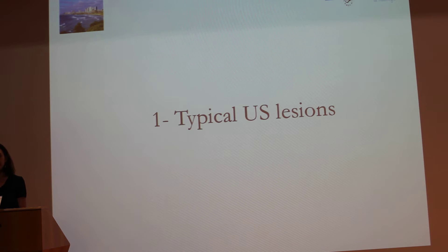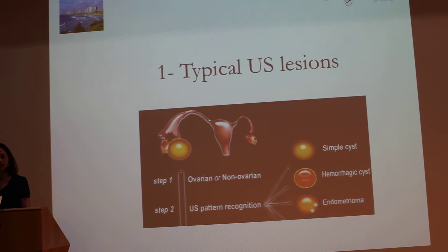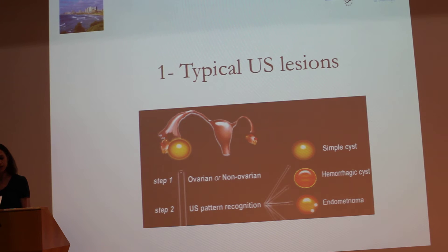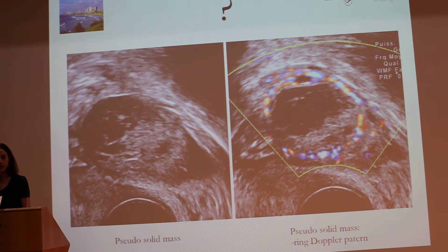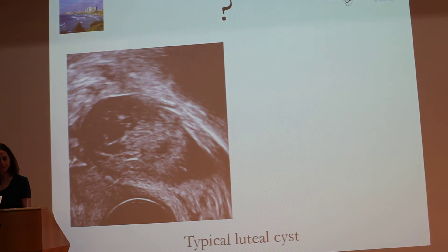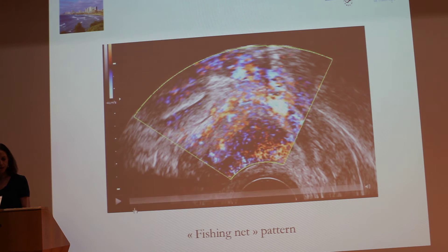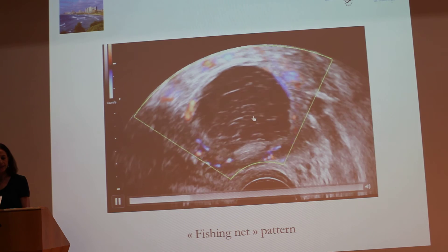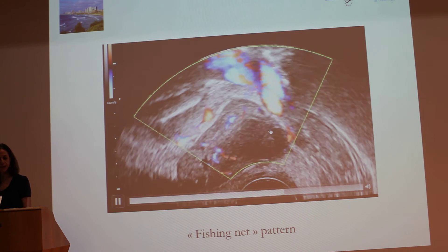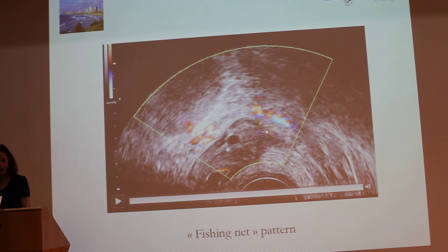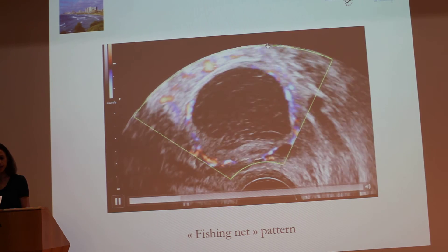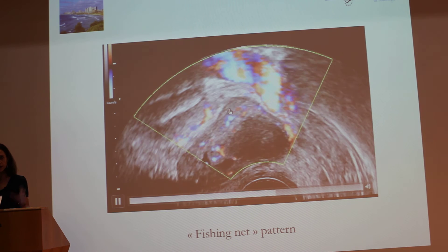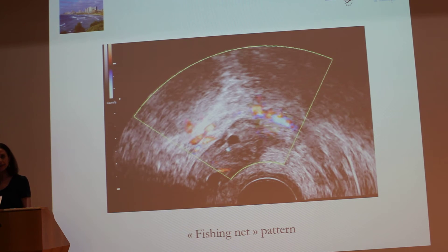The first situation is the easiest: the typical ultrasound lesion. The three main lesions are simple cysts, hemorrhagic cysts, endometrioma, and dermoid cysts. Here you have a pseudo-solid mass — perform Doppler and it is a typical luteal cyst. The fishnet pattern seen here is called fishnets; here is the endometrioma, and here you have the typical luteal cyst with all those little parietal lesions with no Doppler signal.